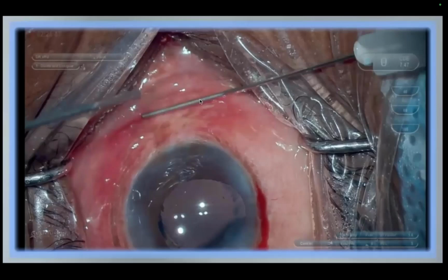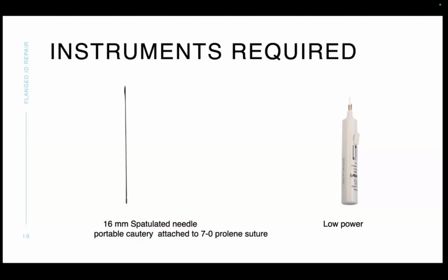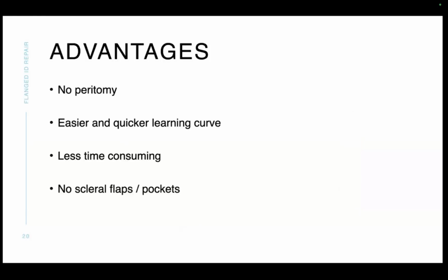When you have to do this, all you need is low power cautery to do these flanging techniques. This works on the dry principle, not the wet principle. Our regular wet field cautery will not work. And then you need this spatulated needle suture, which Alcon makes for us. It comes in both 7/0 and 6/0.